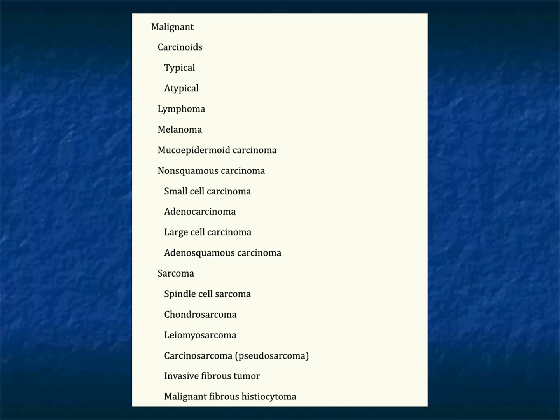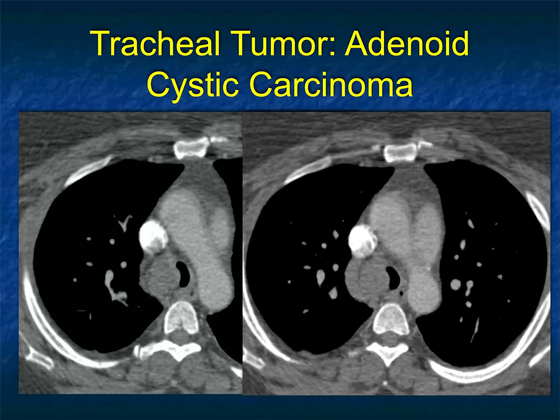The squamous cell is number one in frequency, and the ACC — adenoid cystic carcinoma — is number two. This was an adenoid cystic carcinoma, just a beautiful example compressing and narrowing the airway. The tumor is in the wall of the trachea. We usually think of tracheal involvement by extension from lung cancer or lymphoma, but you can think about primary tracheal malignancies. This was a great case.